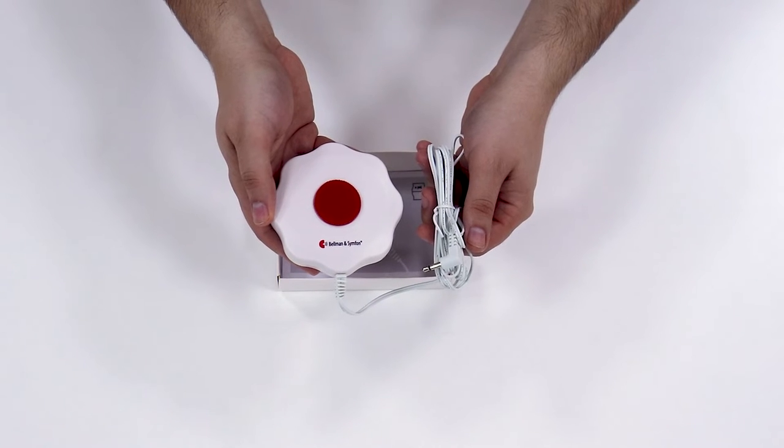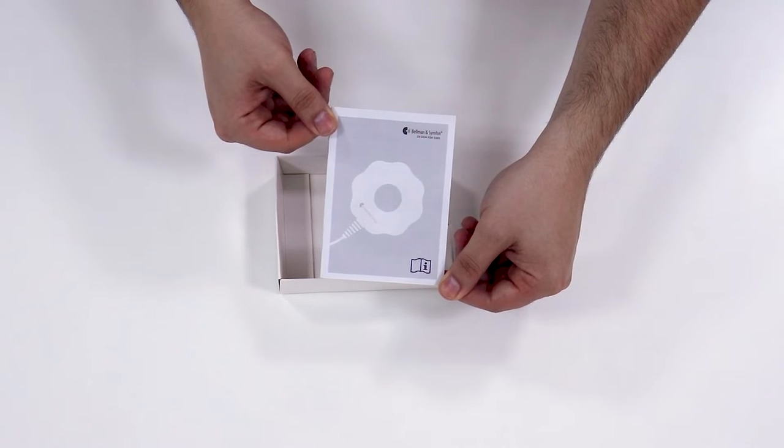Let's look inside the box. Here is the Bed Shaker and a user manual.